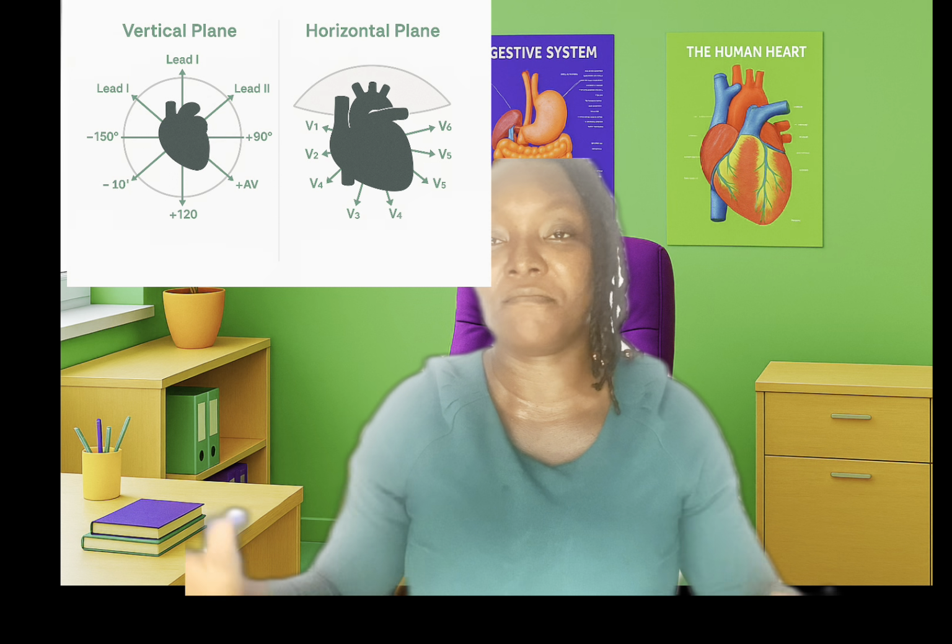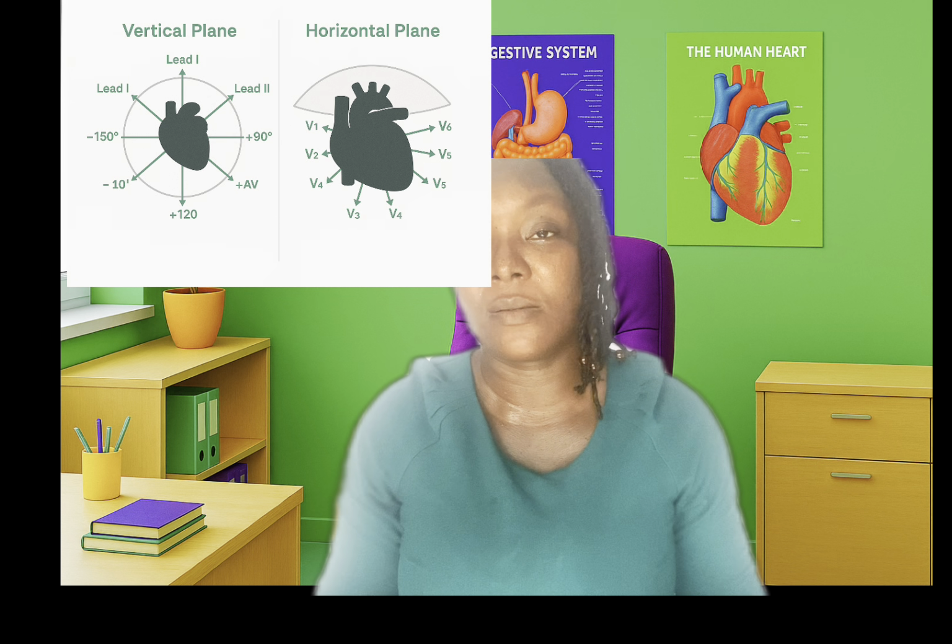You know that it's all about physics. This one coming, then we get the resultant and then we put it there. Now when it comes there like that, some groups of leads, just as it is designed or tested and proven, they look at the heart in a particular angle.